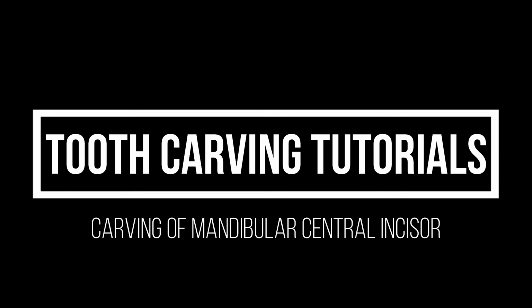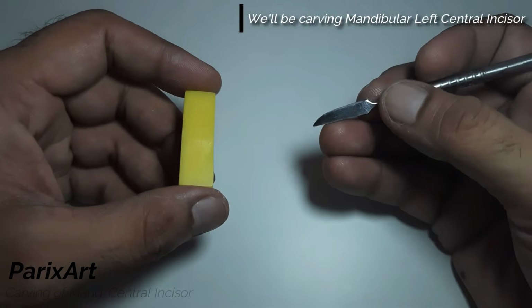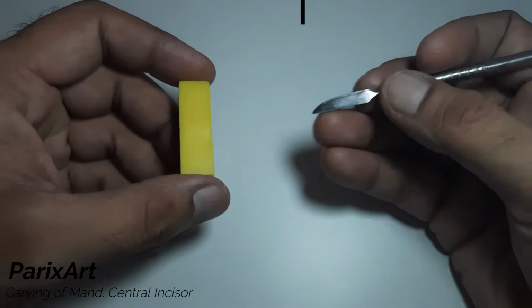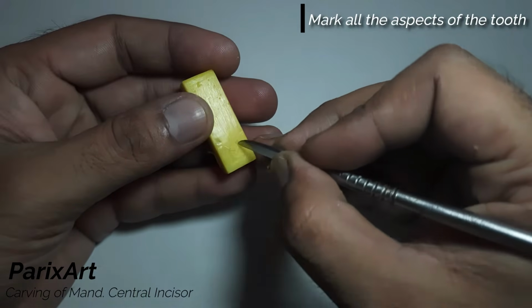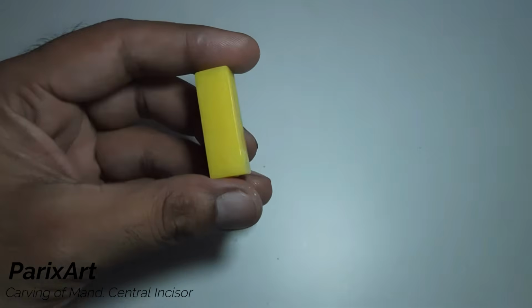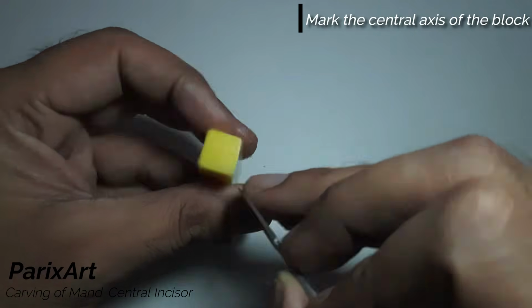Today we'll be learning how to carve a permanent mandibular central incisor. So let's start. First we'll start with marking of aspects of the tooth: labial, distal, lingual and mesial. We'll mark LI for lingual. Now we'll mark the central axis of the tooth, just a rough guideline, and connect these on the top.